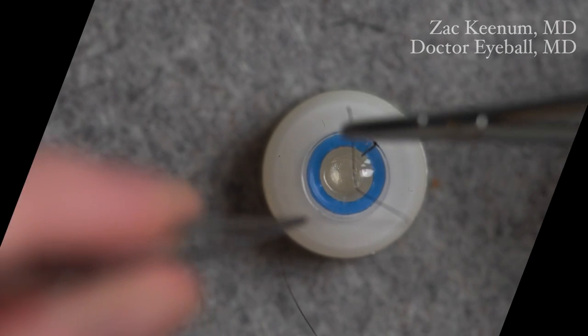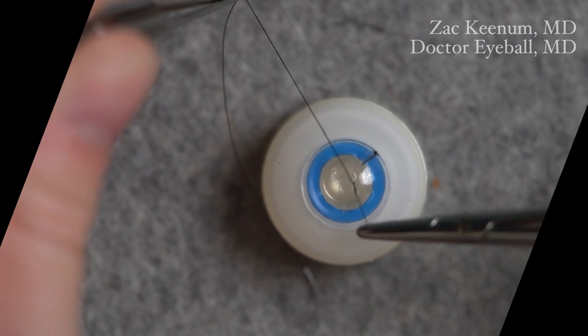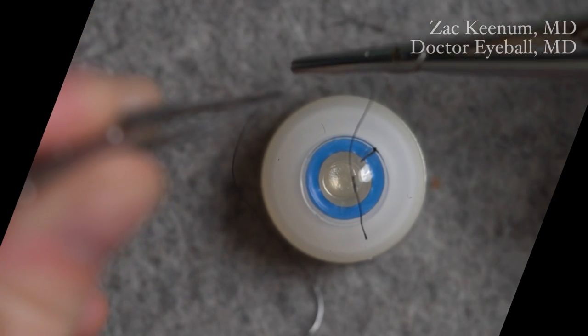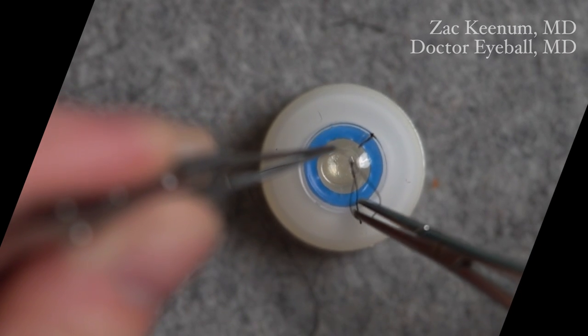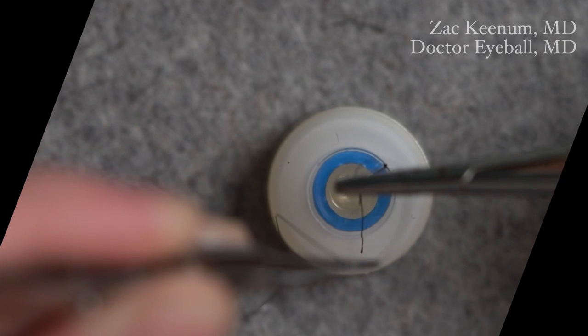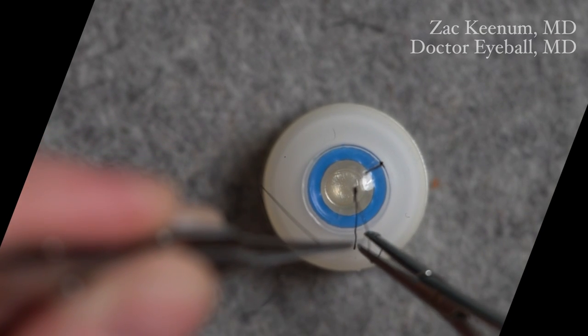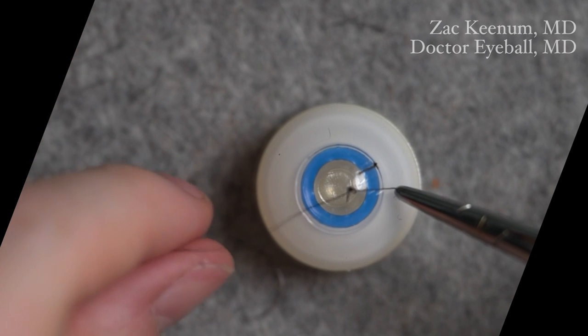Let's watch one more time for completeness. First throw from the inside; come from the back, sweep around and under, grab the short, don't cross. This creates the slip knot — that's the adjustable part. If we're ready to lock it, do a regular throw, pull 90 degrees, and it locks it.